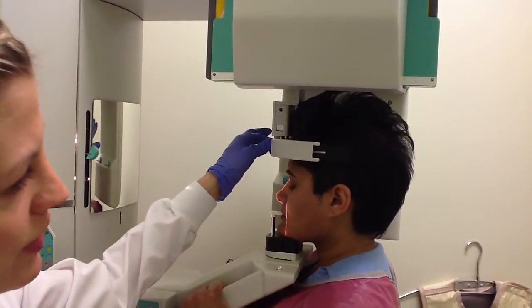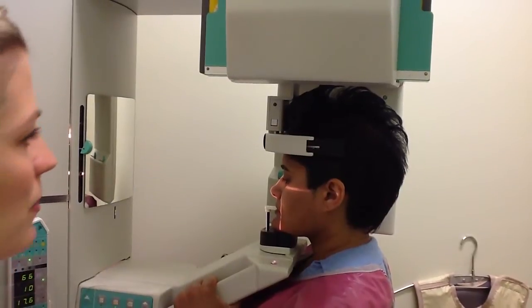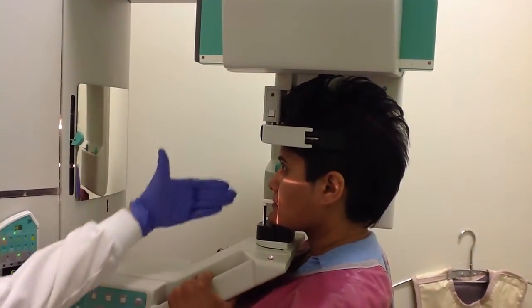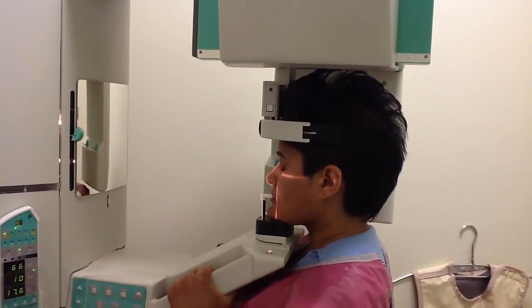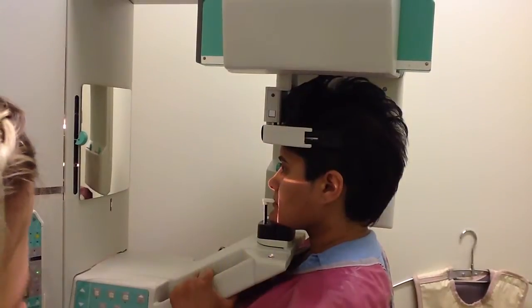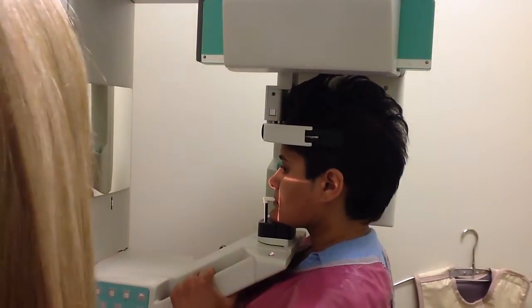So again, just offering support because we want the patient to be as still as possible through this exposure. Okay, so continuing to be on midline, keeping everything in the center there, that looks good. I see that she's set up profiles straight and her horizontal line is parallel to the floor. She's standing as tall as possible, which is great.